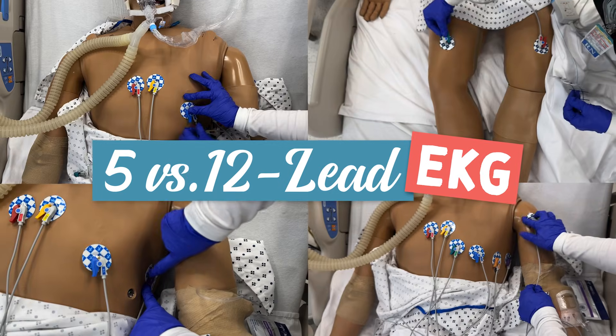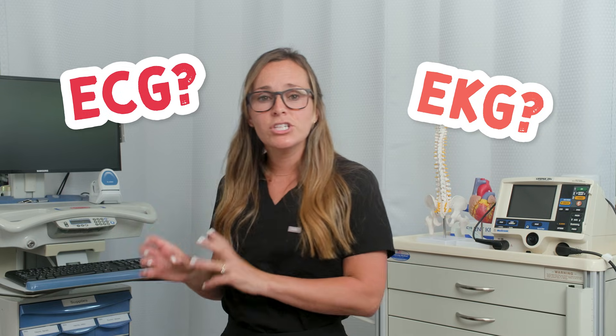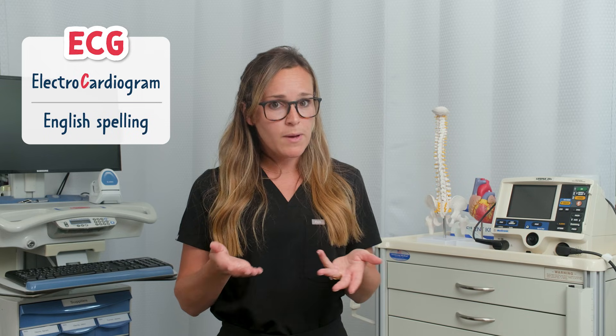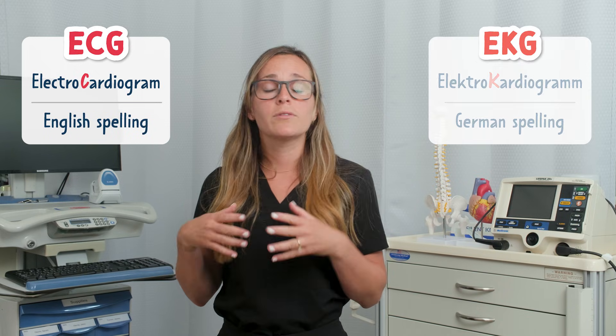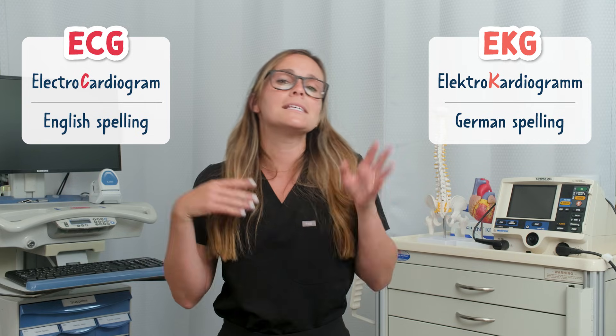Let's go over replacing a 12-lead EKG. You might hear both ECG and EKG used when talking about heart monitoring and wonder if there's a difference. The answer is no — they're the exact same thing. ECG stands for electrocardiogram, the English spelling, and EKG comes from the German spelling, electrokardiogramm, where K replaces the C.